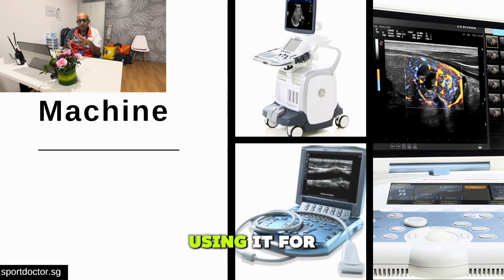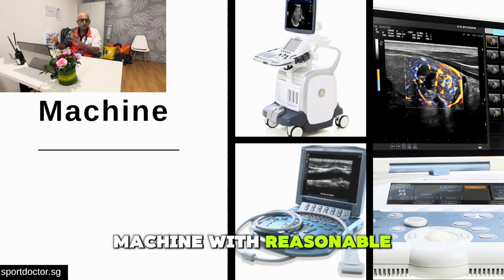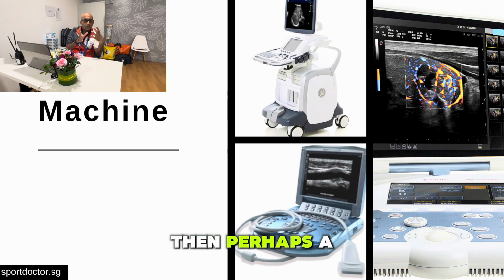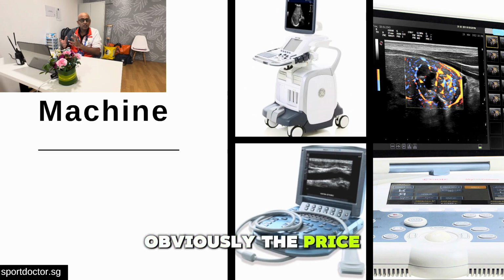So if you are going to be using it for diagnostics, then it is important to have a machine with reasonable function and resolution. If you're looking at it from a more basic assessment perspective, say the pitch side, or if you're going to be using it for very basic interventions, then perhaps a tablet would be appropriate to use. It also depends on the budget that you have in mind. As we go up towards the pedestal machines, obviously the price will increase. But with that comes functionality and a greater degree of accuracy in terms of your imaging.